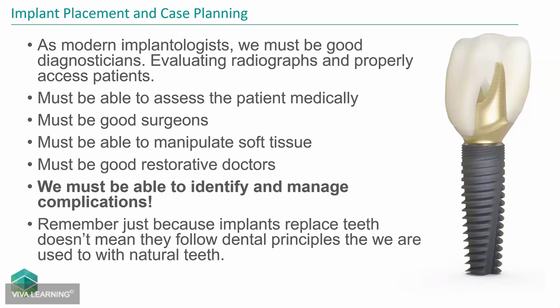We need to look at them medically, look at the radiographs, and assess what we think we can do. Then when it comes to the actual surgery, being good surgeons, soft tissue work, planning for the restorative procedure, which is always what matters in the end. And most importantly, which I've always said, as a GP, identifying and managing complications is probably the hardest, but the most important thing that we need to be able to do.